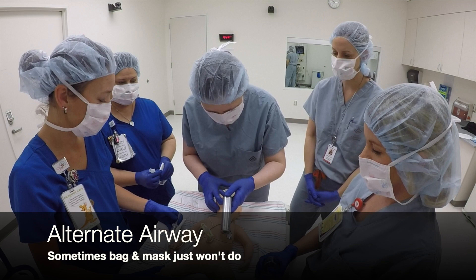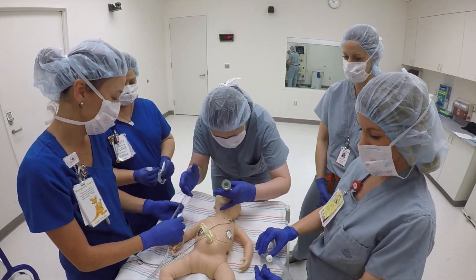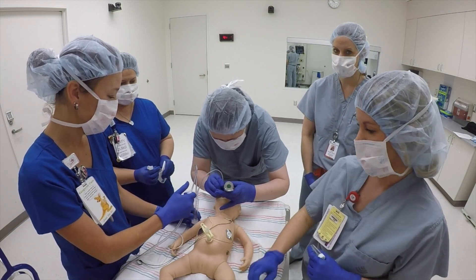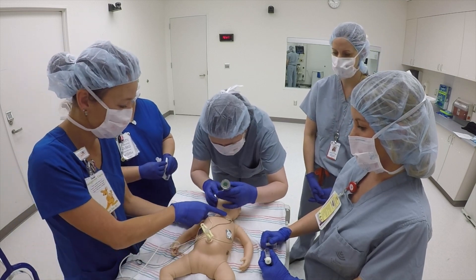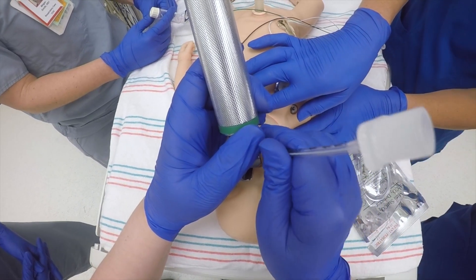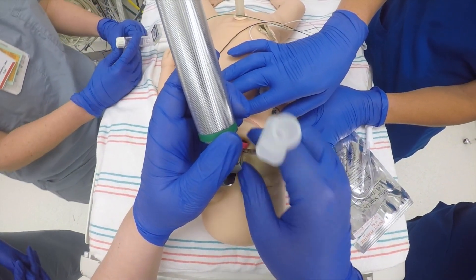I'm going to go ahead and intubate. I'm putting the blade into the mouth — there are a lot of secretions. May I have suction please? Alright, please suction now. Much better. Can I have some cricoid pressure? Holding cricoid. I need an airway. I see vocal cords and we are through.